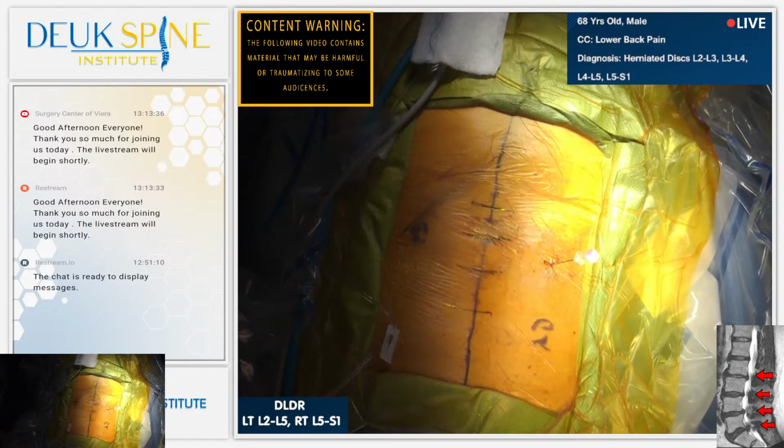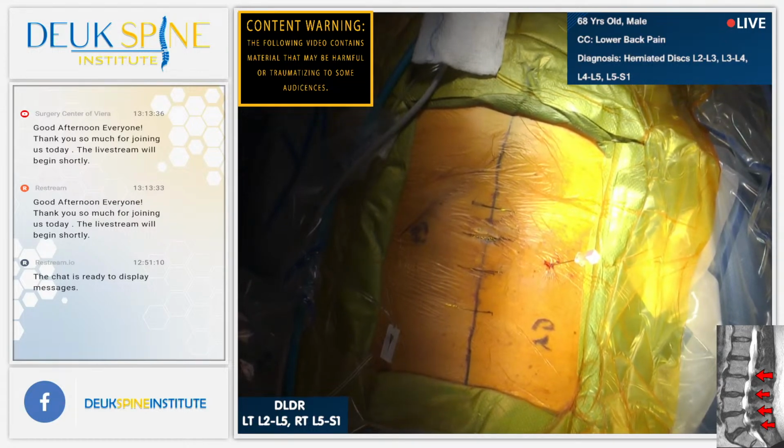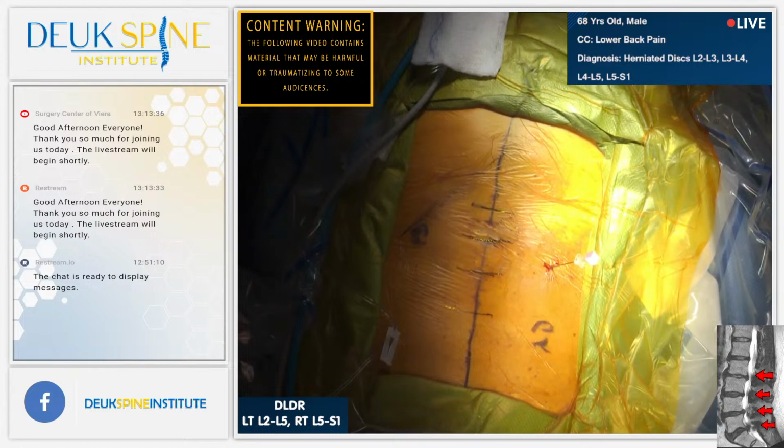All right, welcome back. Now you see why herniated discs actually cause back pain. It's inflammation. Inflammation in a tear that's located in the back of the disc, called an annular tear. Now, let's look at the x-ray. And Jordan, show us this thing.